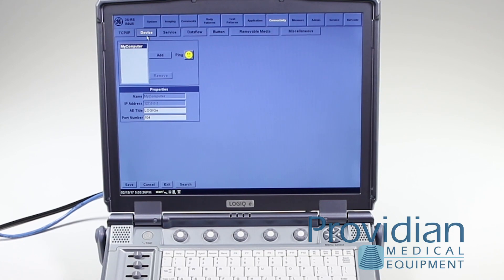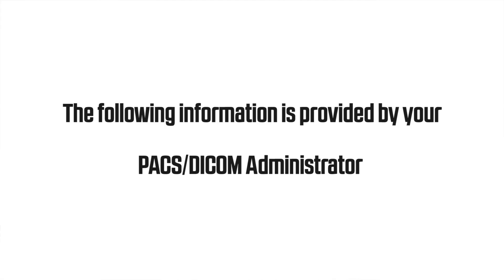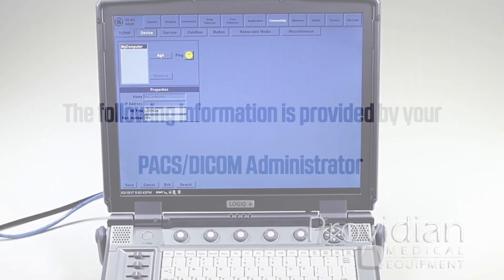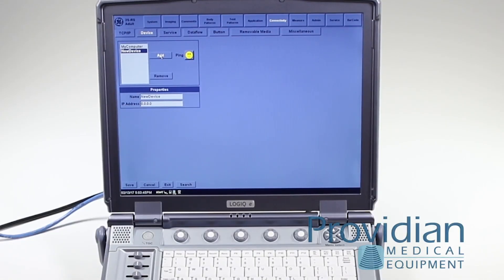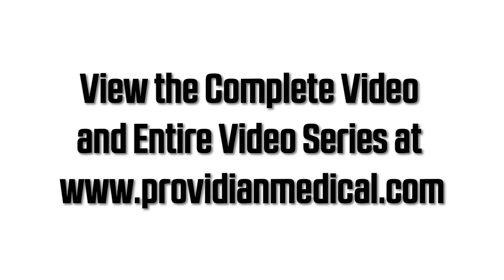Next, go to the device section — this is the server you're going to send images to, and your DICOM administrator would have given you this information. Go ahead and click Add. This is where it's quite different from other machines: you're actually entering the DICOM server in a couple of different ways.